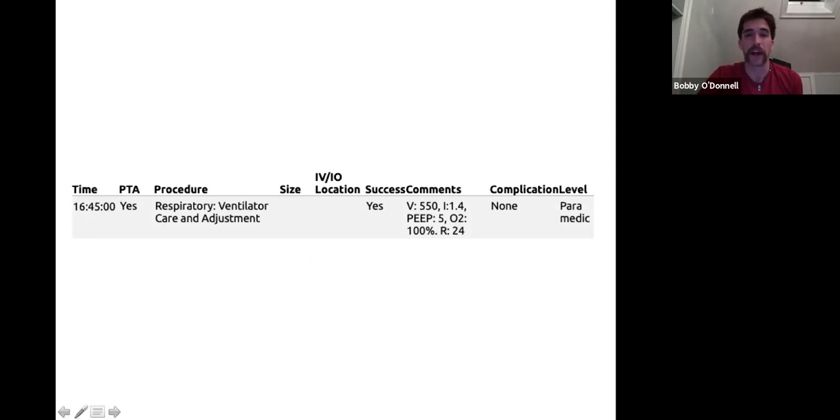And that's really important. Some of the questions that we're looking at in this vent CQI module, just so you're aware of, will help us with the documentation. And we're going to try to stay on top of this. I've been looking at a lot of the vent calls since we've gotten it up, in case you forget, I can ask you while it's still fresh in your mind. I want to know if our vent was used, or if you took the hospital vent.